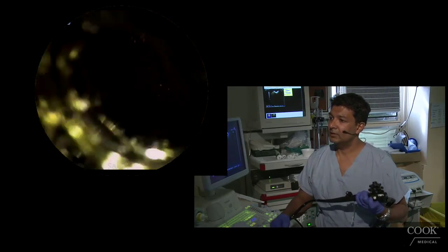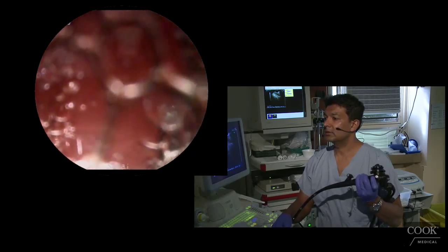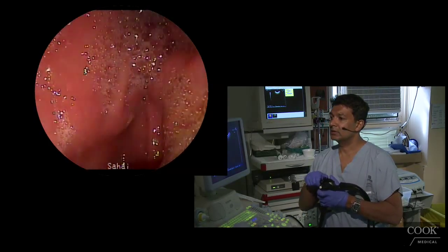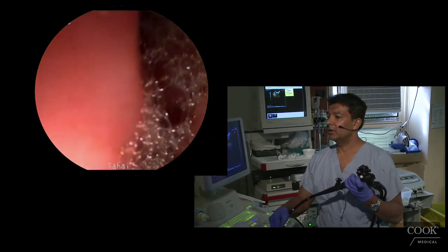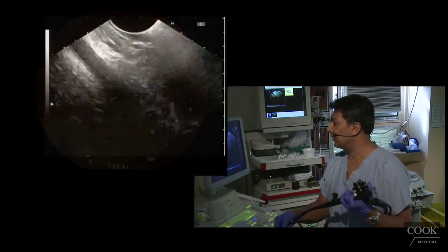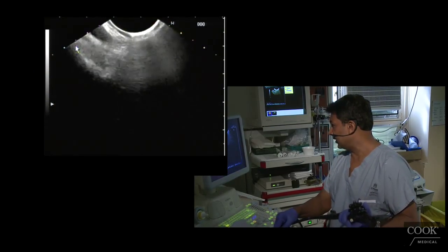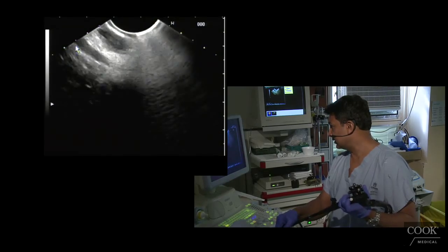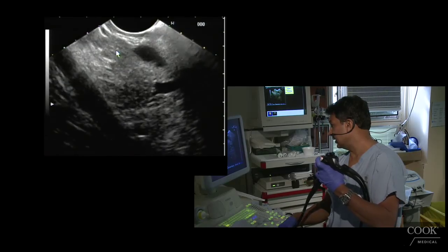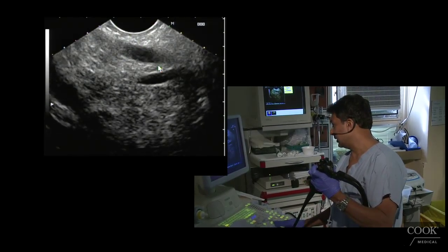There we go. Where's his pylorus? That's up there. Okay, so look at the apex, tip up, go left. There's the portal vein here. You want to get deep in the hilum, then torque right. There's the bile duct, following it down into the head right there. So there's the bile duct and the PD right there.